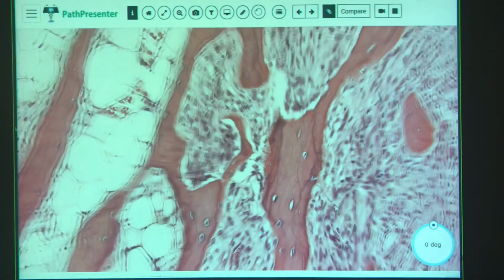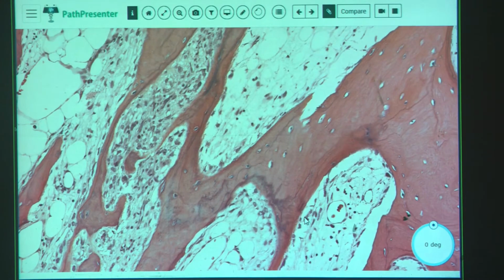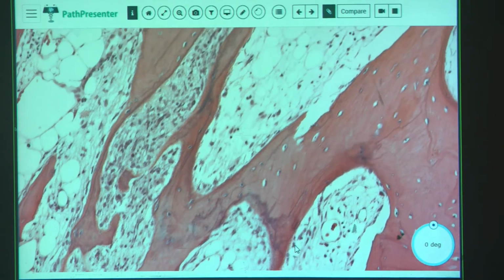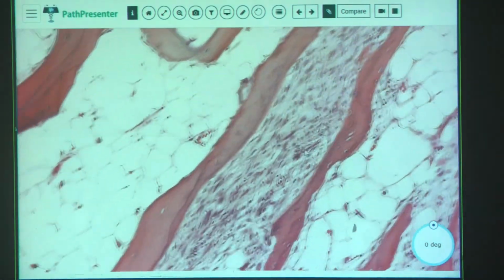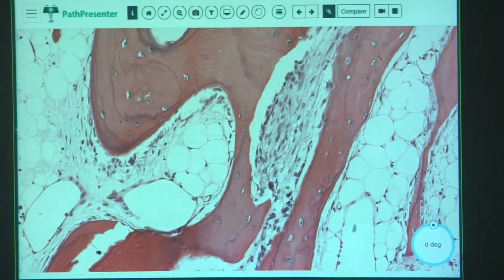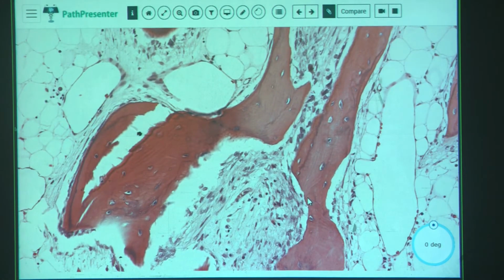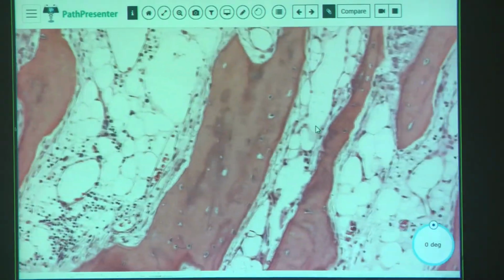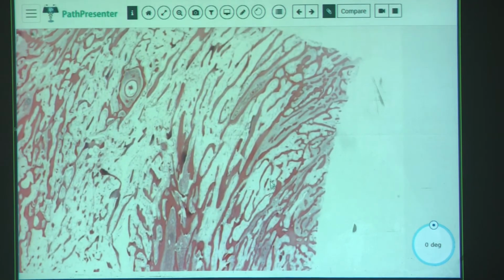Maybe that's one. I don't know. I'm not totally convinced of that, and you don't need them either, so is there some osteoblastic rimming? Yeah, maybe here some osteoblastic rimming. What else can you see? Kind of it to show you on this slide. So the parallel appearance, that's the biggest thing to help you.